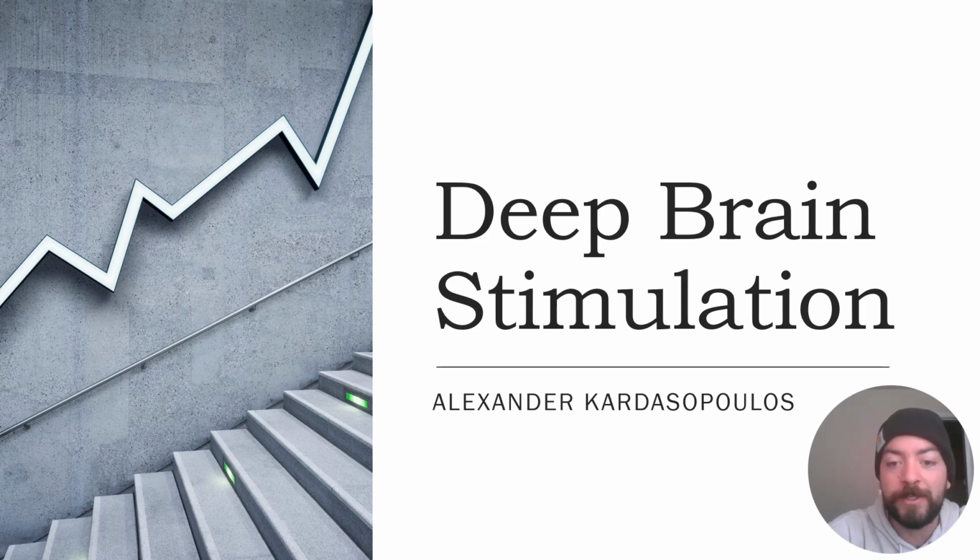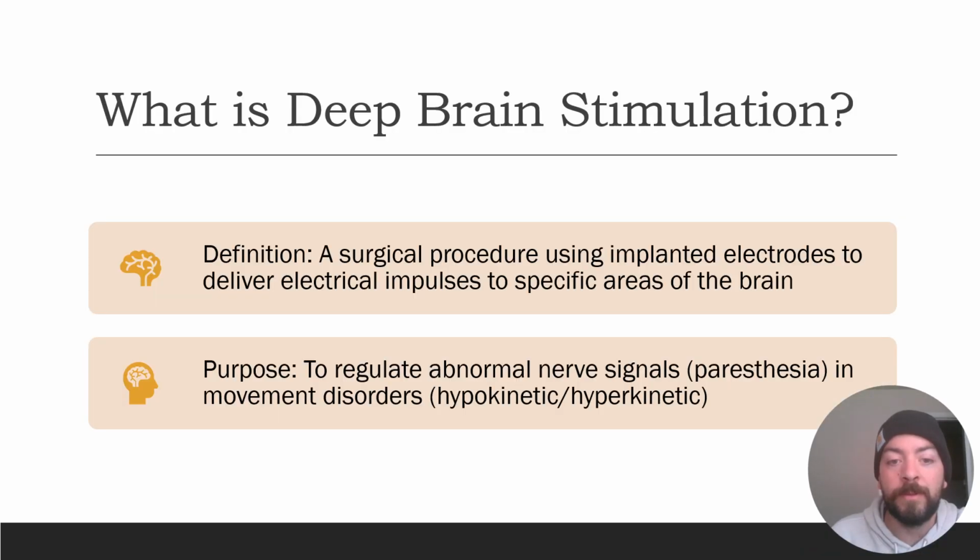I'm doing my presentation today in the field of neurology, and I'm talking specifically about deep brain stimulation and what it is. Deep brain stimulation is a surgical procedure using implanted electrodes to deliver electrical impulses to specific areas of the brain. The purpose of it is to regulate abnormal nerve signals in movement disorders, either hypokinetic, which means less movement, or hyperkinetic, which means too much movement.